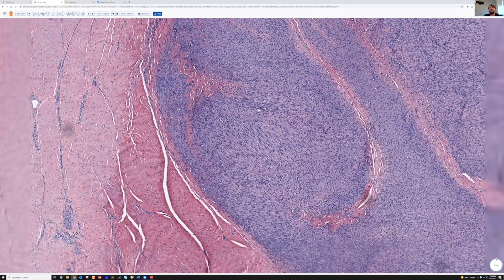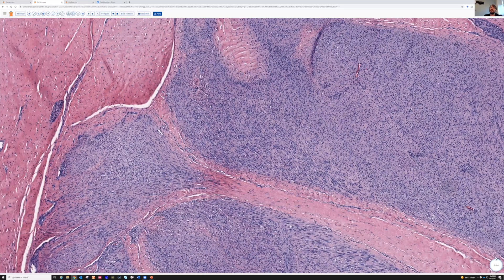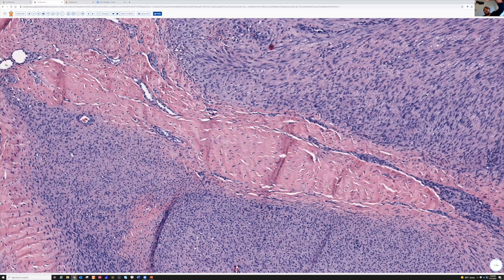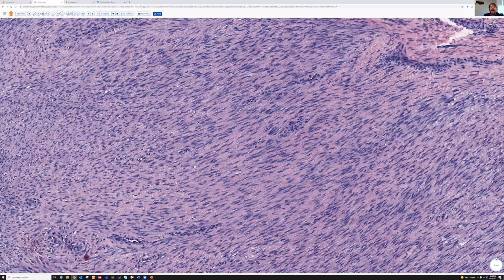Here's another area where you can see the broad sweeping fascicles — the entire screen, all of the fibroblasts running the same direction. I say fibroblasts, but actually a lot of times these will have some actin expression, so fibroblasts and myofibroblasts. From a morphology and immunostain perspective, fibroblasts and myofibroblasts tend to exist on a spectrum, and many lesions that we call fibroblastic will have some actin staining. I kind of lump them together for practical purposes in diagnostic soft tissue pathology.